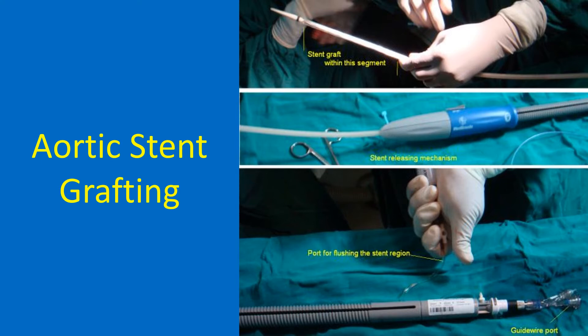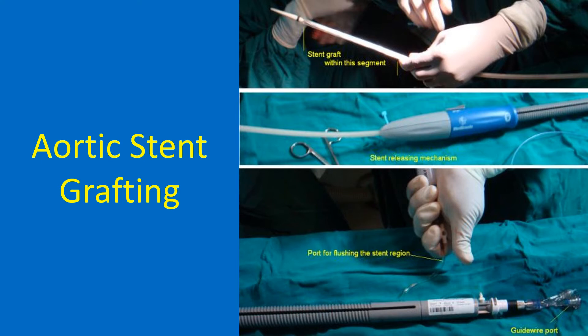The aortic stent graft delivery system is quite long and thick, requiring a femoral artery cut down for introduction. If the diameter of the femoral arteries is small, it may necessitate an external iliac artery exposure.